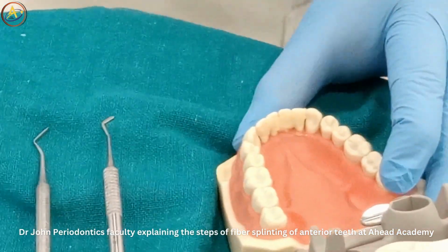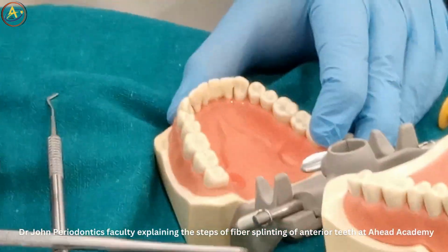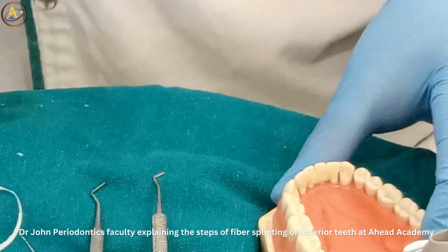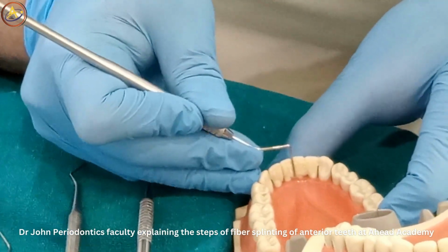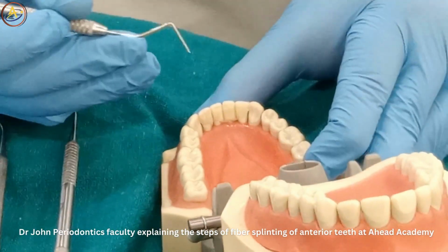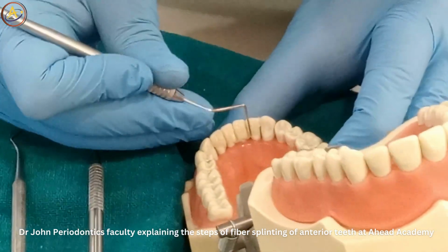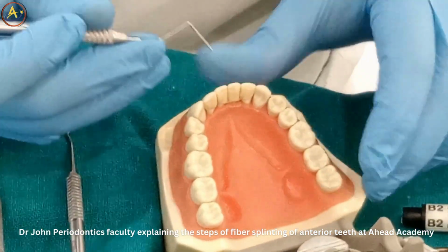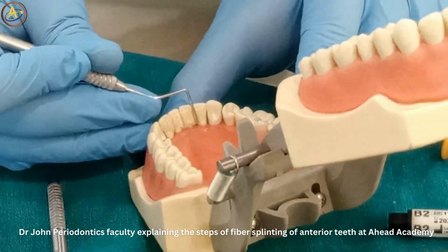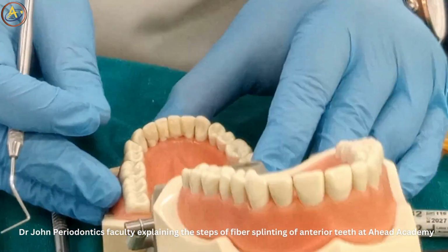The most important point, interdental curing. See, you have to take a straight probe, and what you do, this is the main point, interdental locking. This gives a patient a tooth-like feeling, and he will have no over contacts, no feeling that something has been applied to my mouth, that I can't open or close my mouth. He will have a perfect feeling, and the splinting is also protected in a normal way.